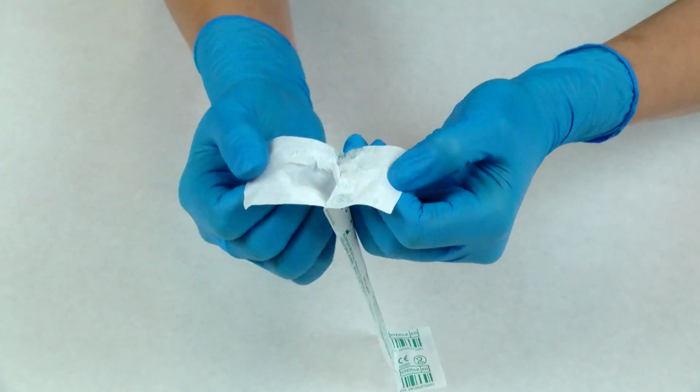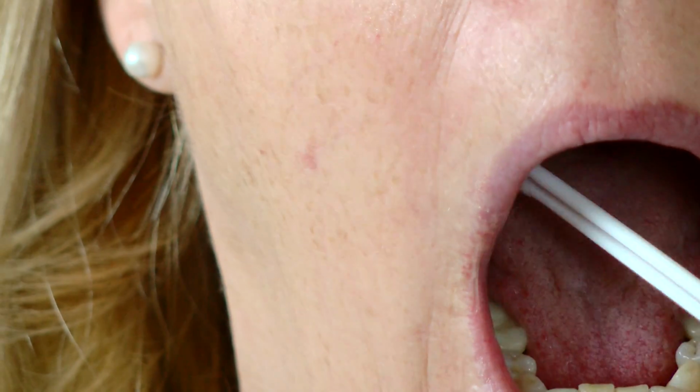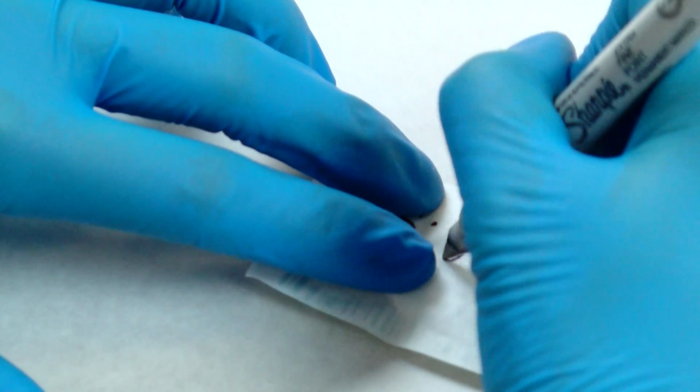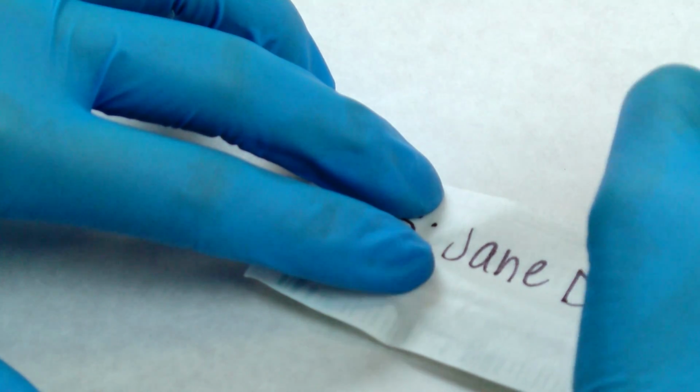Make sure the package containing swabs has not been opened or tampered with. It is recommended to swab the inside of both cheeks for up to 15 seconds. This allows for the skin cells to attach to the swabs. Once finished, swabs should be placed back into the sleeve packaging. Write the name of the person you swabbed in permanent ink on the outer swab packaging.